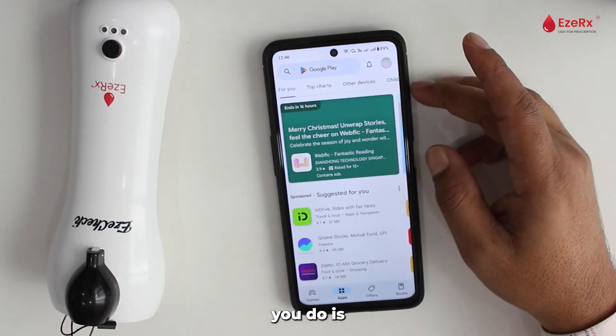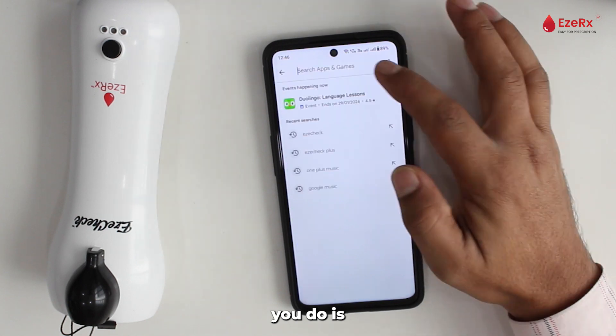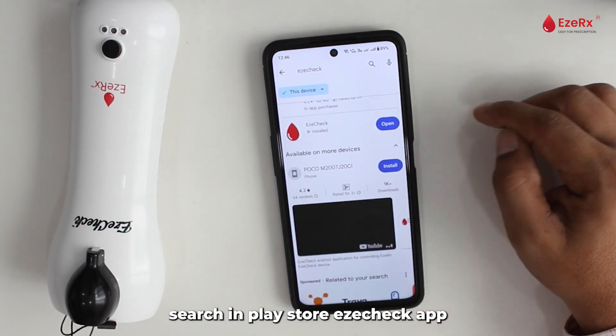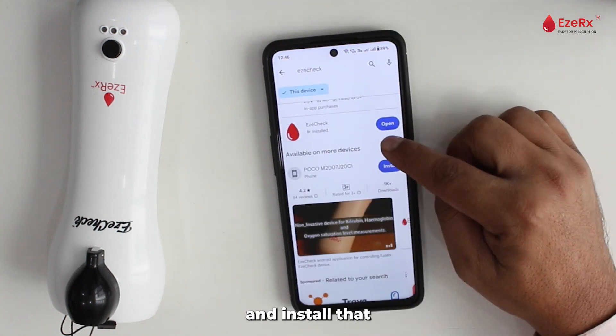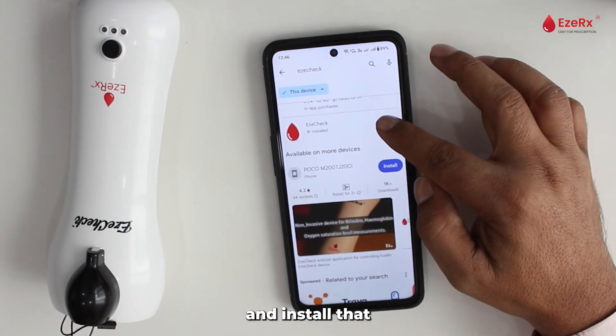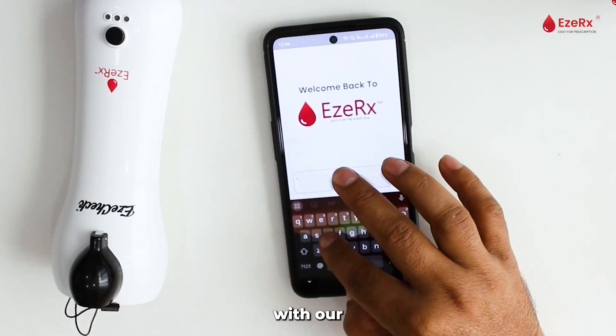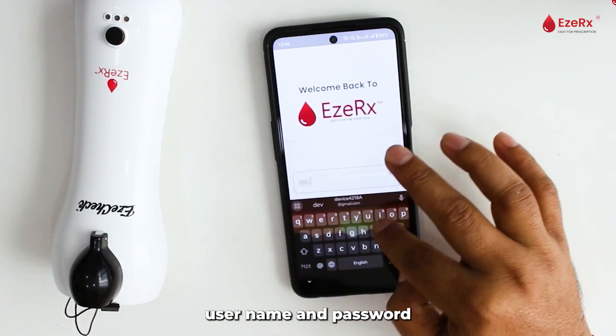The first thing you need to do is search on the Play Store for EZ Check and install the app. Then we shall launch it with our username and password.